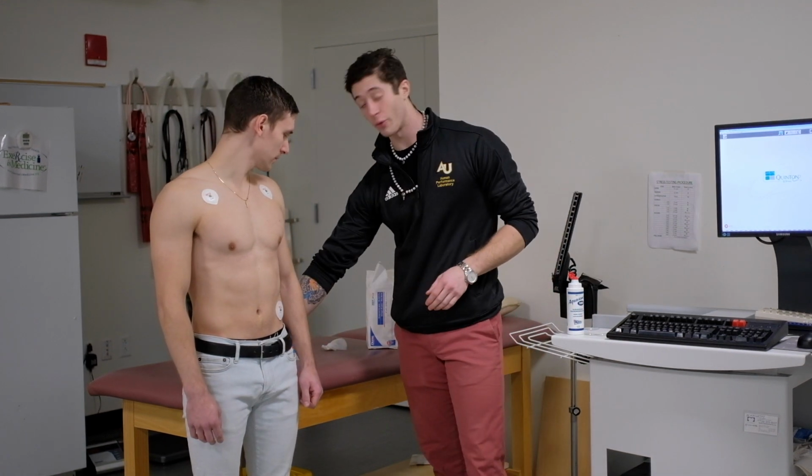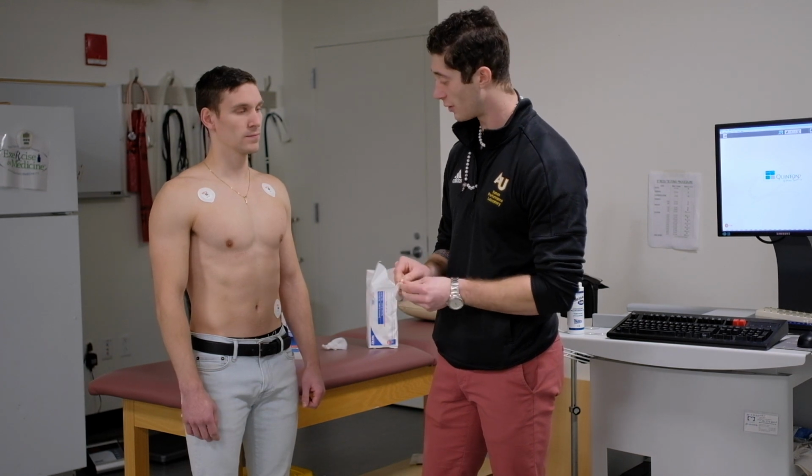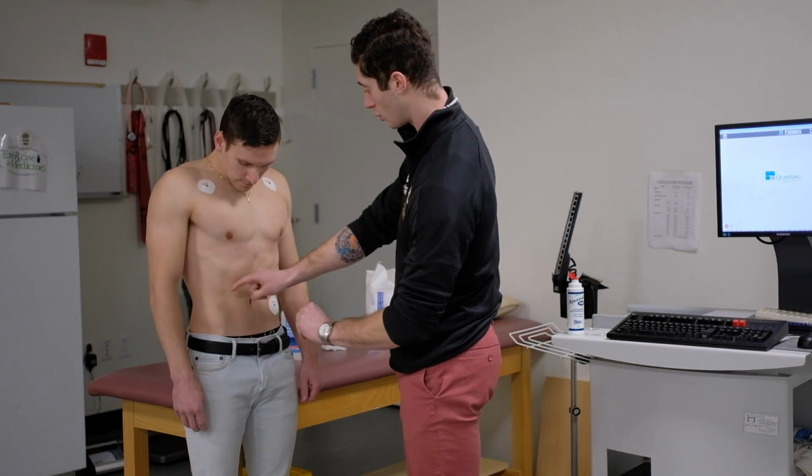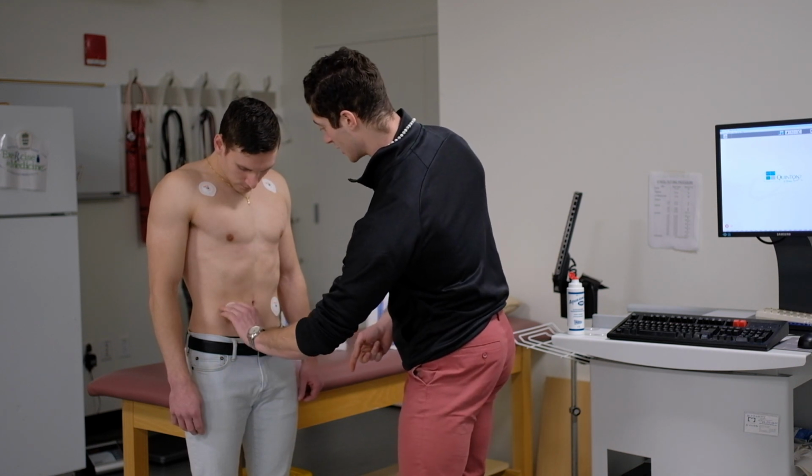Same thing for the right leg and right arm. If you would suck in for me, that would be fantastic. Thank you. Find the end of the rib cage, find the top of the hip, and go ahead and place the electrode.